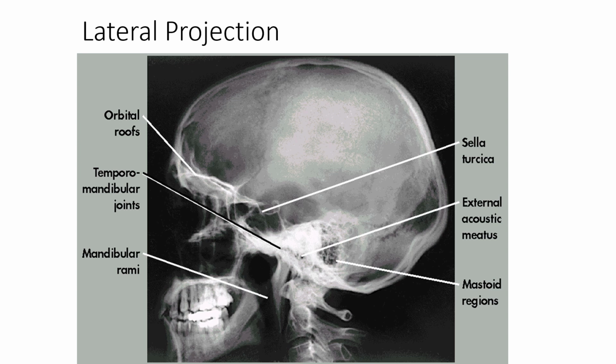So the EAM is surrounded by the petrous pyramids, the petrous section, so the bright white part in the center there, that is looking down the gun barrel, if you would, of the patient's ear, with the gun barrel center being the EAM.